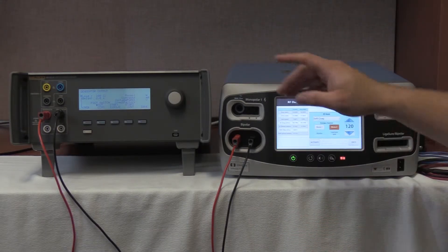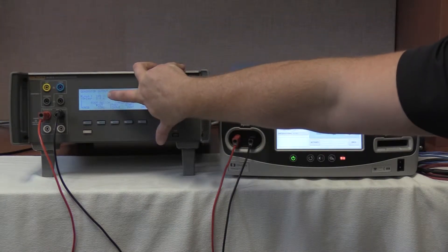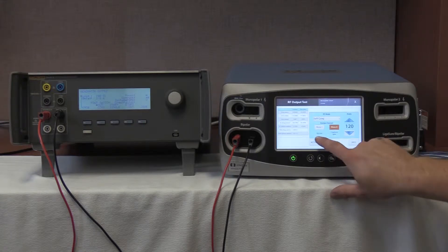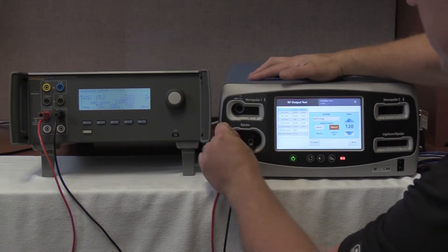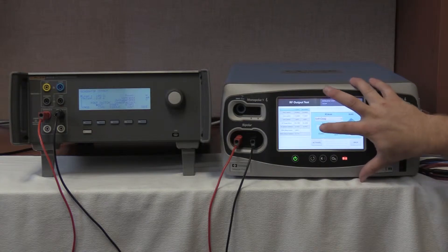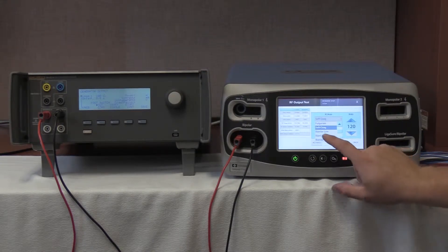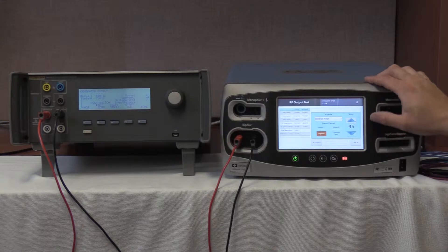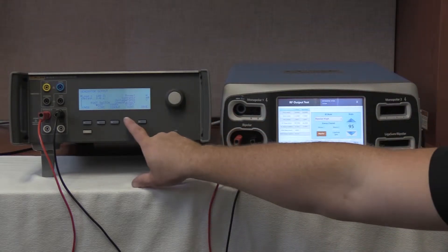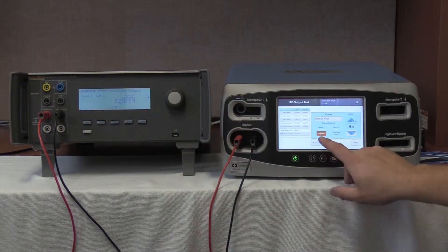We are now going to select a 100 ohm load on our QES3 by rolling down to 100 ohms. Once 100 ohms is selected on the QES3, we are going to go to our FT10. We are going to select bipolar, then go to bipolar high, and select 95 watts by pushing the up arrow. Once at 95 watts, activate — or start continuous — on the QES3 by pushing F4, and on the FT10 press activate.